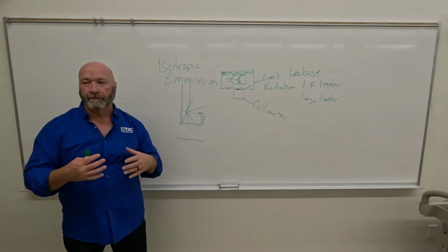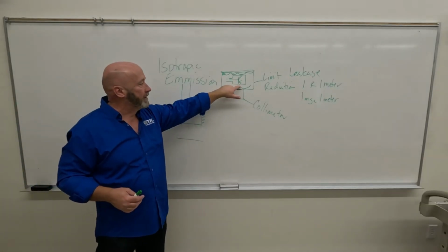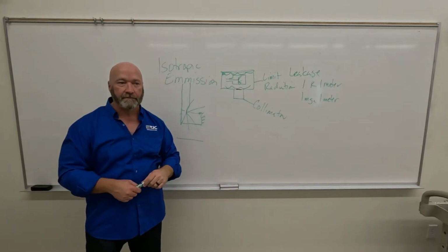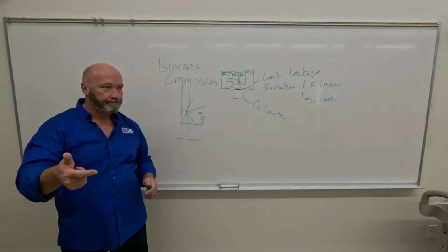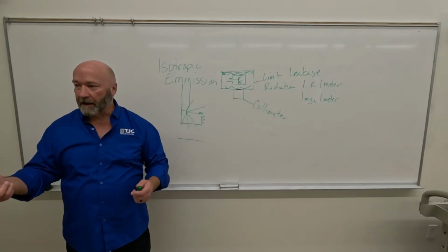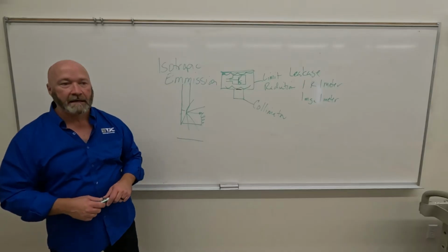We've got thermal radiation from the anode to the glass, conduction into the oil, and then convection as we blow the air across, right? So it protects from heat, protects from rough handling, also protects from electric shock. So it protects from a lot of different things.